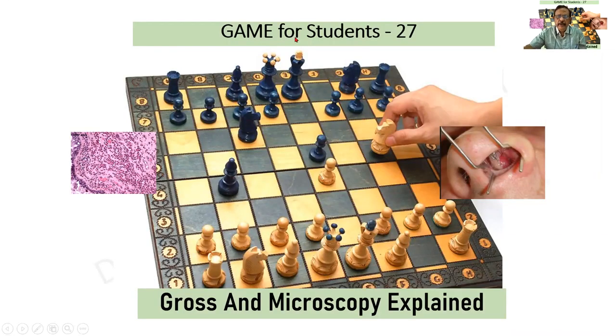Welcome students to game 27, Gross and Microscopy Explained. This is a very simple topic, a slide that is kept for you, easy to identify.